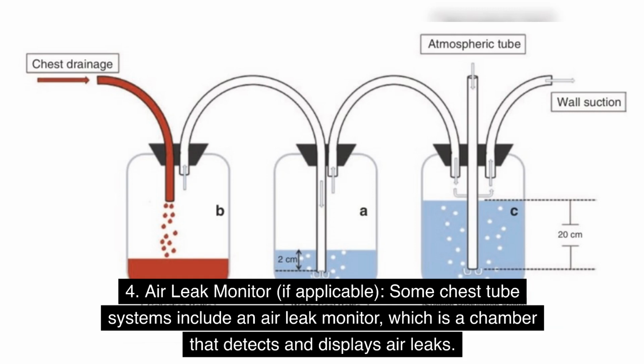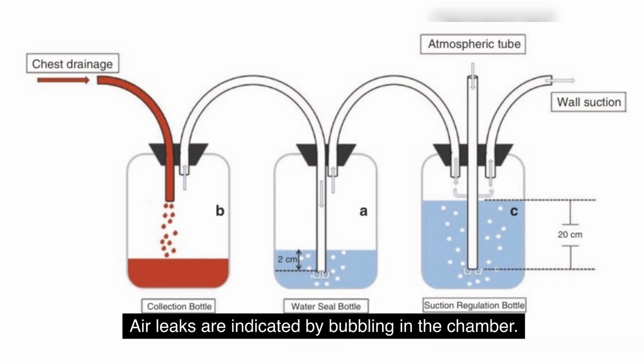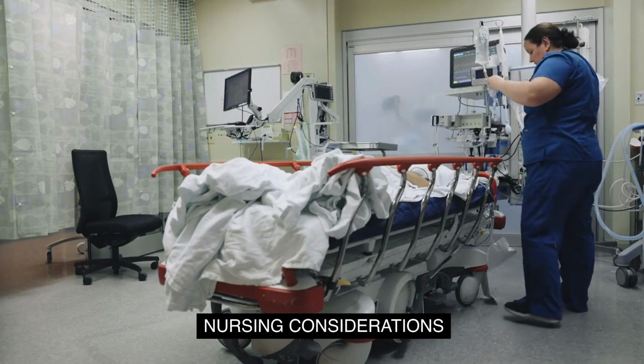Some chest tube systems include an air leak monitor, which is a chamber that detects and displays air leaks. It typically has a column of water and a floating indicator. Air leaks are indicated by bubbling in the chamber. Healthcare providers use this to monitor and assess the presence and severity of air leaks, which can be important in managing conditions like pneumothorax. Nursing considerations.